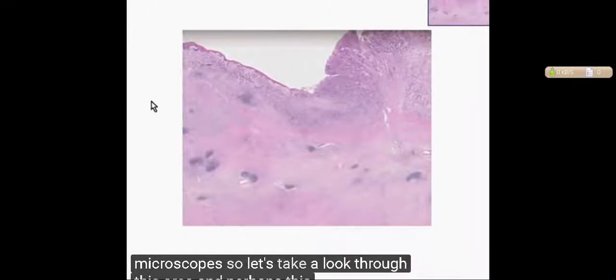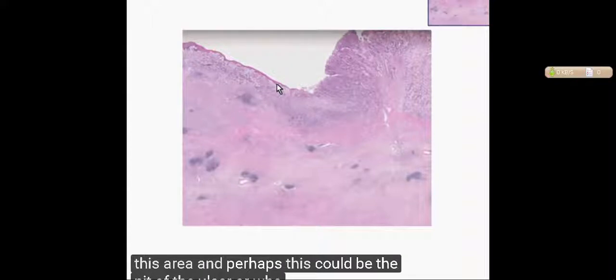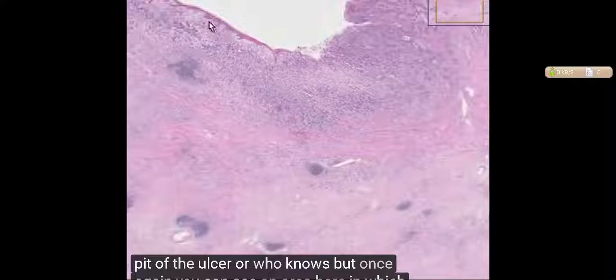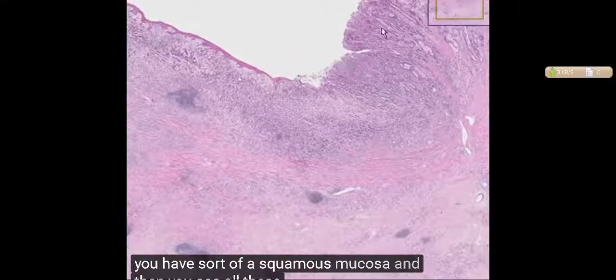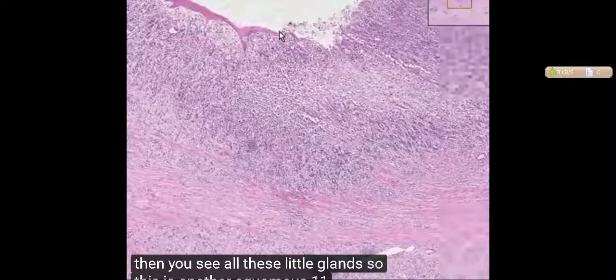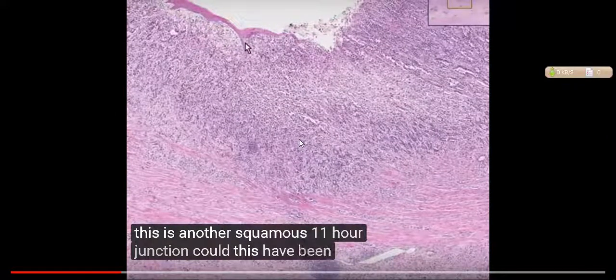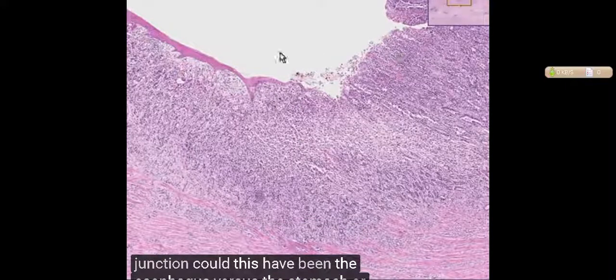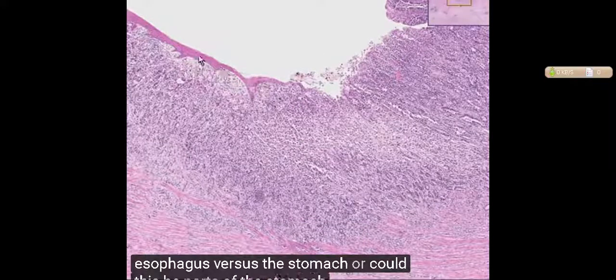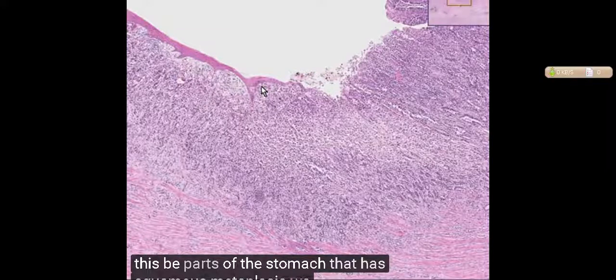So let's take a look through this area, and perhaps this could be the pit of the ulcer, or who knows. But once again, you could see an area here in which you have sort of a squamous mucosa, and then you see all these little glands. So this is another squamocolumnar junction. Could this have been the esophagus versus the stomach? Or could this be a part of the stomach that has squamous metaplasia? We don't know. Doesn't matter.